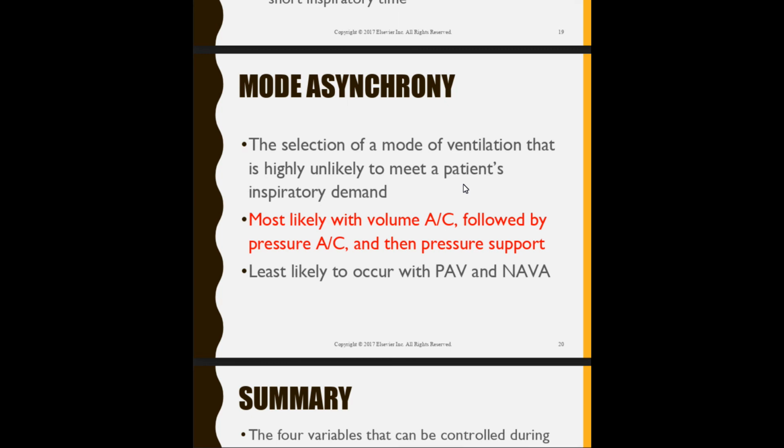Guess what? Most likely the respiratory rate goes down, and they start breathing slower and normally, with a decreased work of breathing. So my mode, my AC/VC, was causing the asynchrony because the patient wanted to breathe on their own. They were stronger in terms of their diaphragm. The neurological signals were going really well. The muscles were much stronger. The innervation of the muscles was contracting really well. So if I kept them on AC/VC, that would cause some patient asynchrony. So switching them to SIMV would be the better choice so that they can breathe on their own.